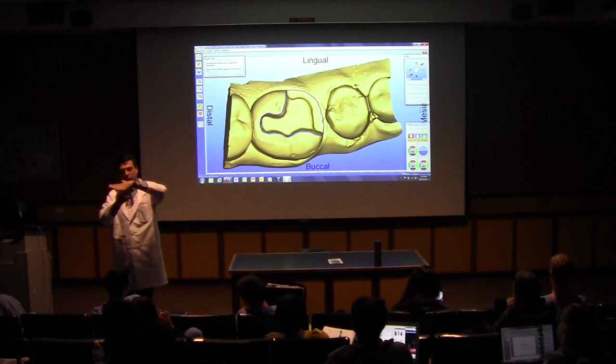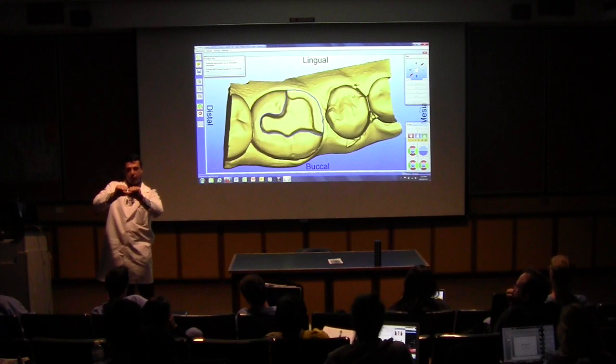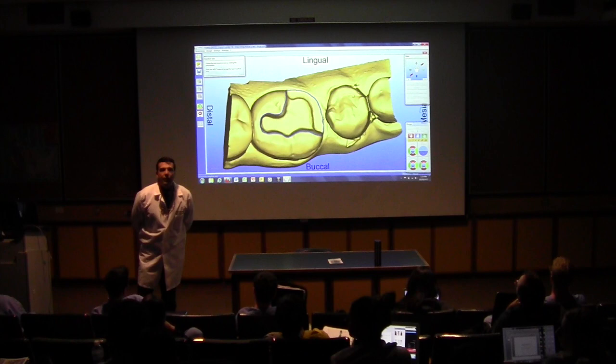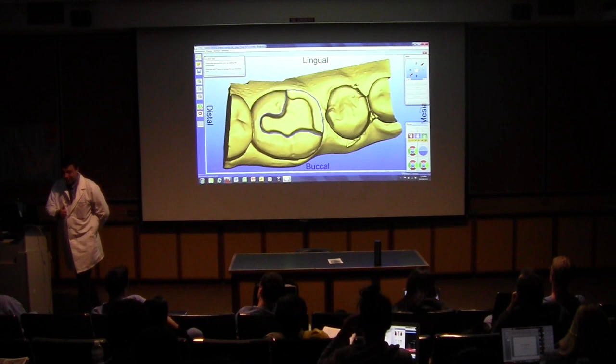Because you took the 3D images in one direction, when you come to this step here, you might have undercuts right here. Meaning you have to rotate this 3D model to explain to the software where exactly the insertion axis is. The prep itself, you don't have undercuts. But the natural position of the tooth might have undercuts. So if you get to the position of the insertion that you want and then you still see undercuts, that's when you look. Right, meaning internally you still have undercuts inside your prep. Is it clear? All right.